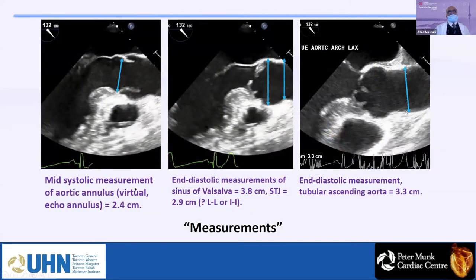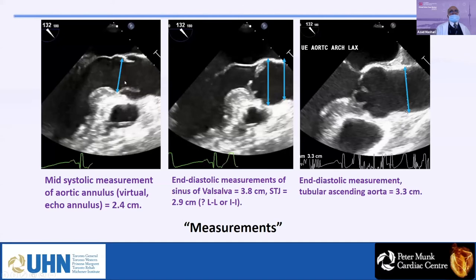For aortic valve and aortic root problems, we measure the aortic annulus, sinus of Valsalva, sinotubular junction (STJ), and tubular aorta. Per guideline recommendations, the aortic annulus should always be measured at mid-systole with the aortic valve open. In this patient, the aortic annulus was 2.4 cm, which is normal — the normal range being 2.2 to 2.8.